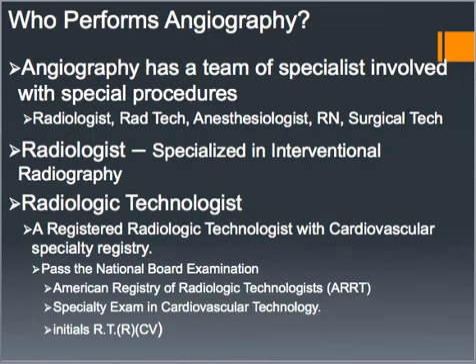So who performs angiography? It is a group of people. There are multiple people actually performing the exam. There's a radiologist, a rad tech, and sometimes an anesthesiologist to sedate the patient. There might be an RN or a surgical tech in there to help assist the doctor with the sterile side of things. It just depends on the facility that you work at. Each of them is a little bit different.